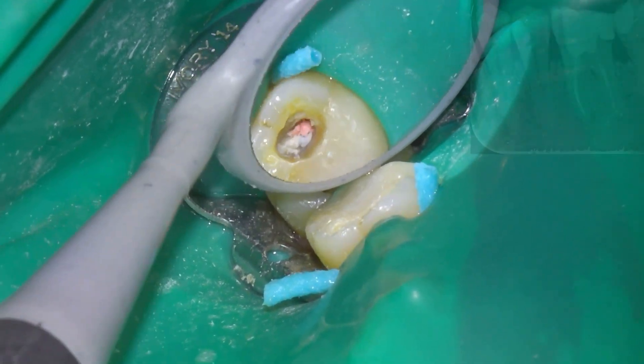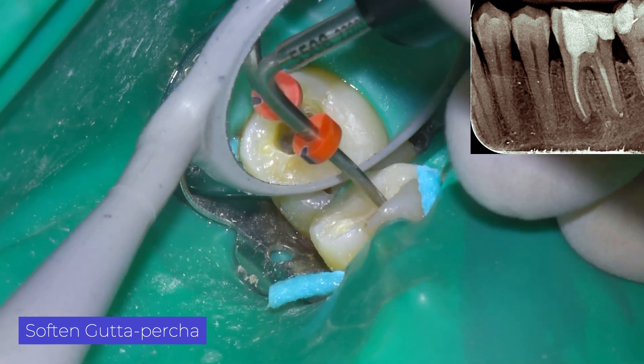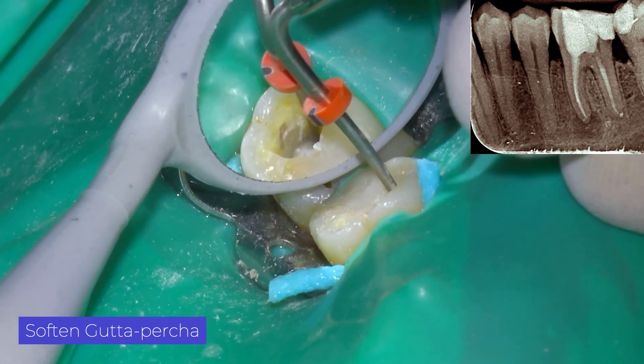We decided to perform a retreatment of the mesial root only, because the distal canal did not present pathology and had a fiber post that was very difficult to remove.